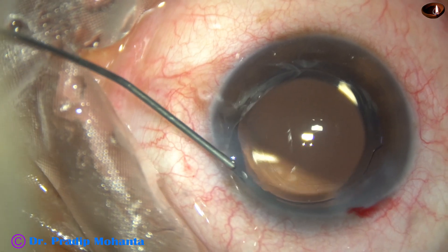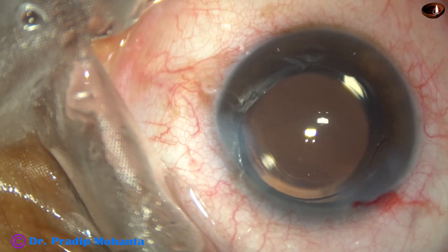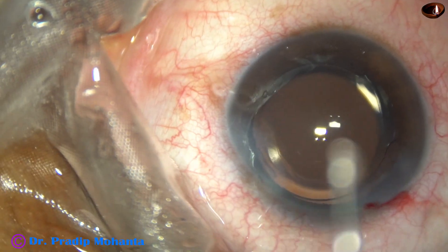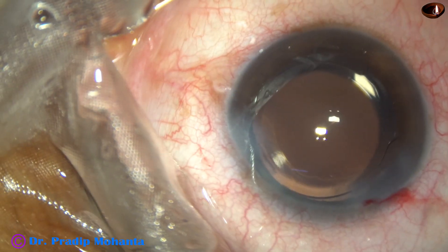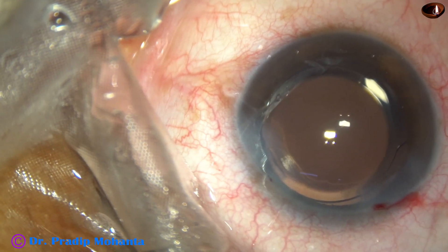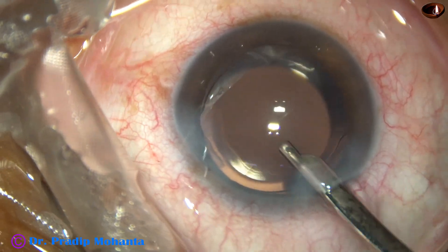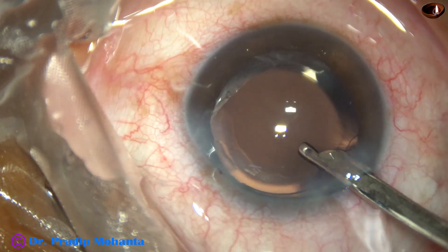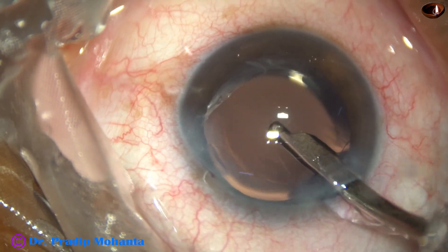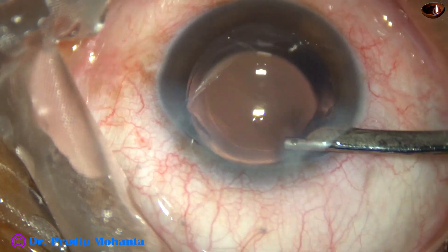The side port is closed by hydrating the corneal stroma and the case is concluded after a final lavage by Simcoe cannula. The anterior chamber is nicely formed by the Simcoe cannula and the case is concluded.